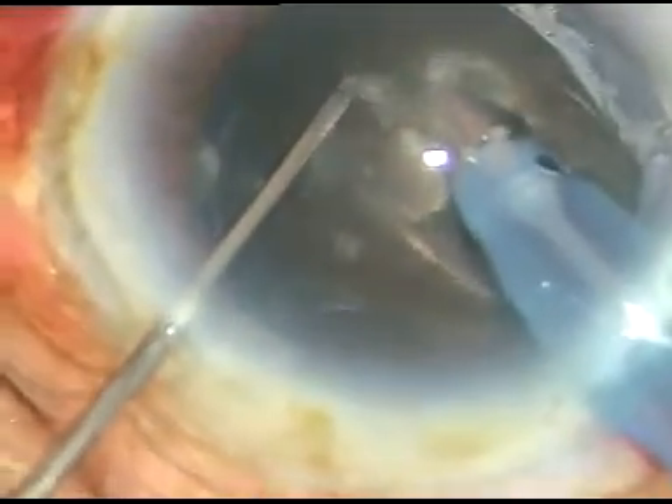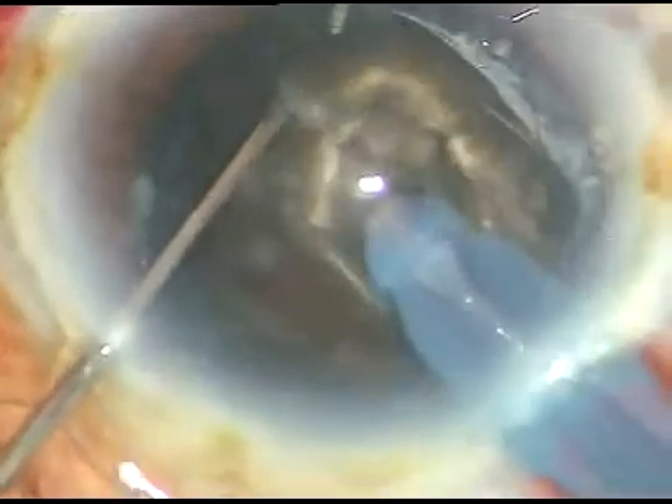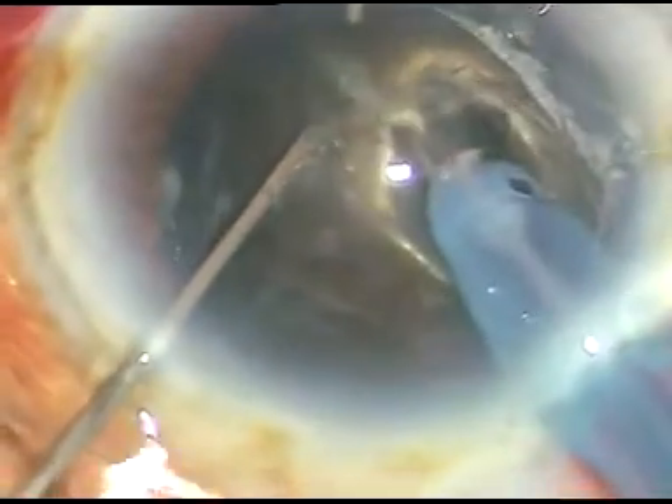The bevel is down. I want to make a deep crater. When I am in bevel-down position, with each application of energy, I can sculpt a lot of lens matter. If the bevel is up, I cannot sculpt out as much lens matter.